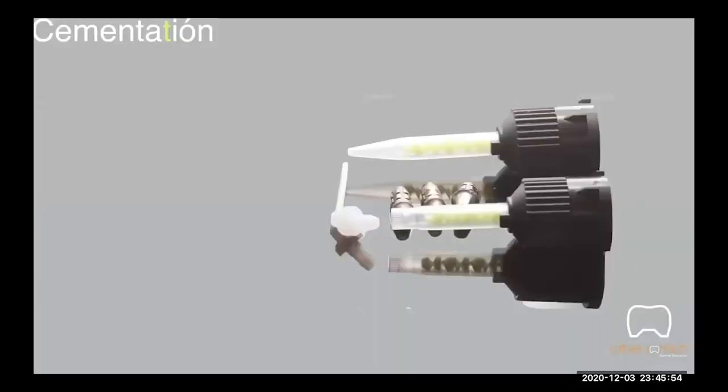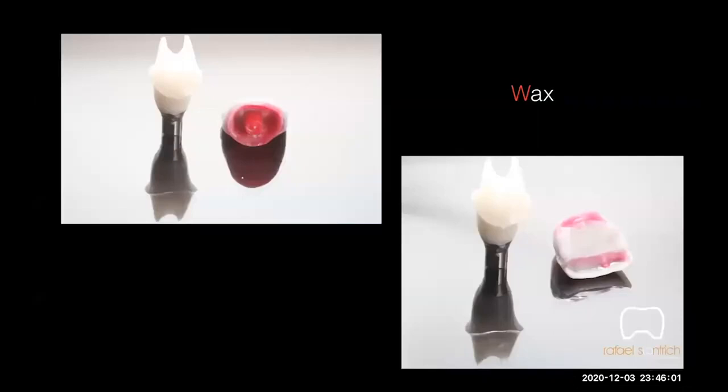We cement the abutment over the Ti-base using Multilink implant cement. Then we use our famous wax. We normally like to use the wax that is for margins, the red one, to cover the base of the tooth. The first layer of the wax, we use the Geo Red. And on top, for us it's more flexible, and then we use the gray one.